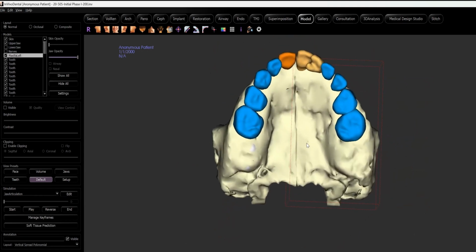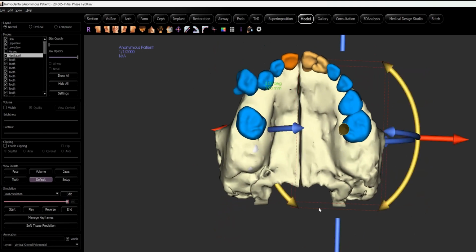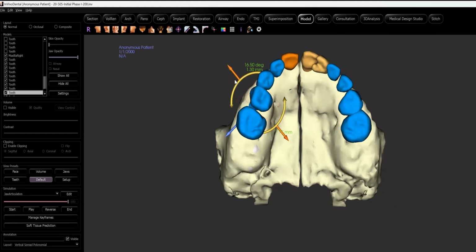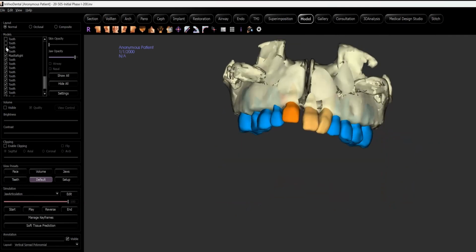This is very important because in our office, depending on your philosophy, we do a lot of palatal expansion. Maybe I should put this baby molar back where it belongs, okay? In the good periodontal housing.